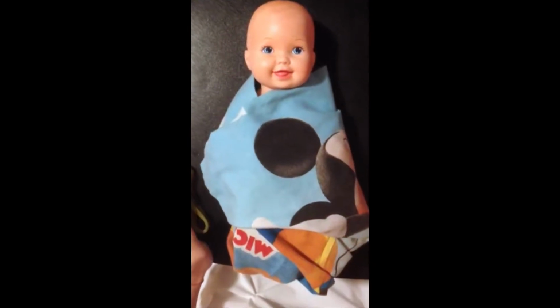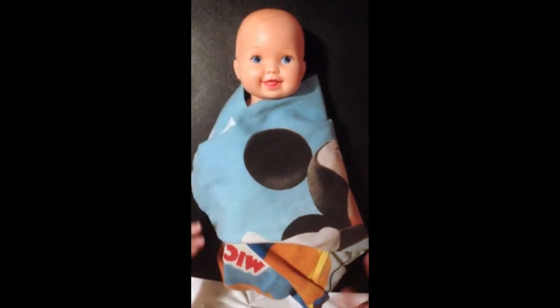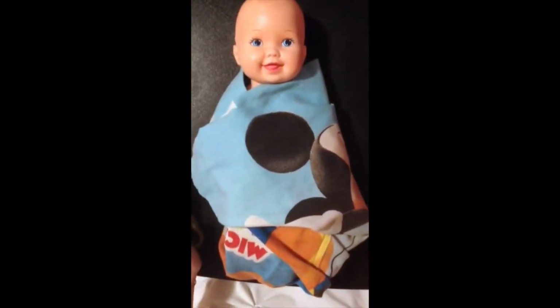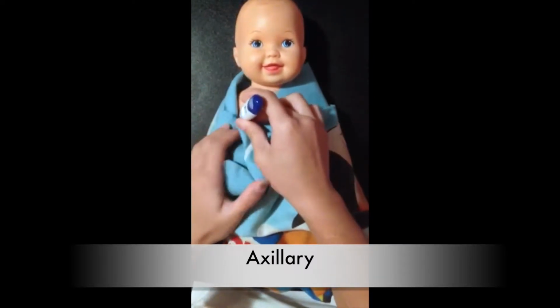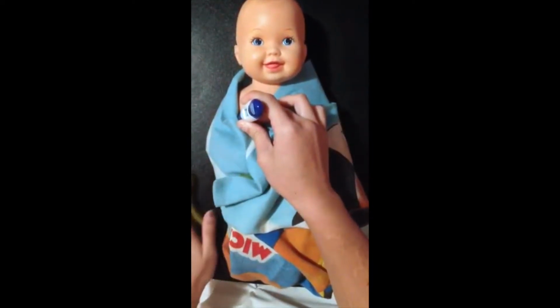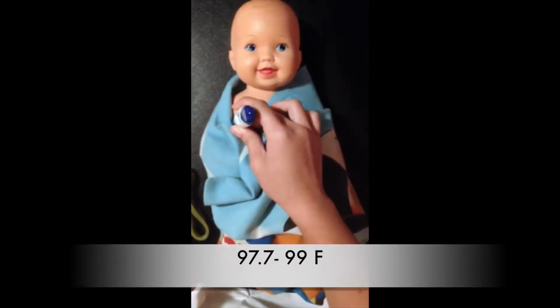To start off the assessment, we'll start from the least invasive to the most invasive, also from head to toe. We'll start by taking the baby's temperature in the axillary position. A normal range for a temperature is 97.7 to 99 degrees Fahrenheit.